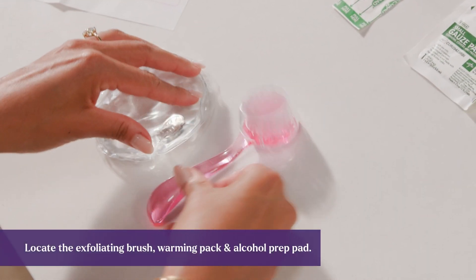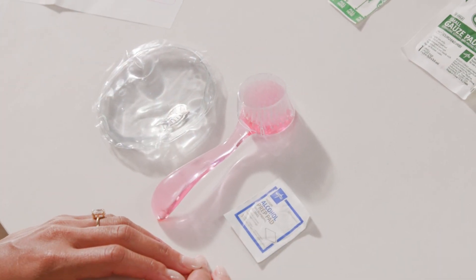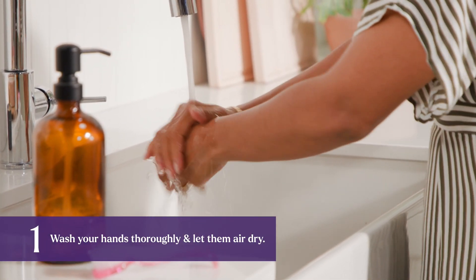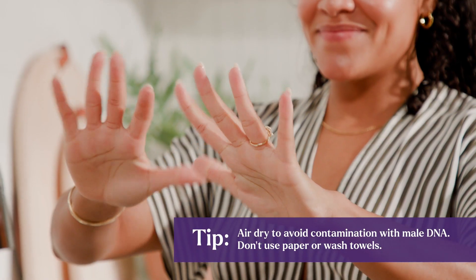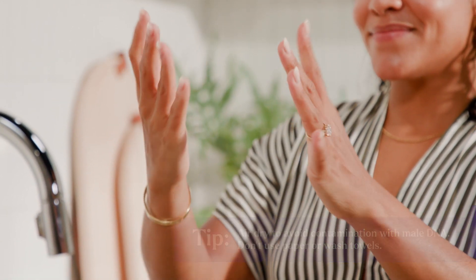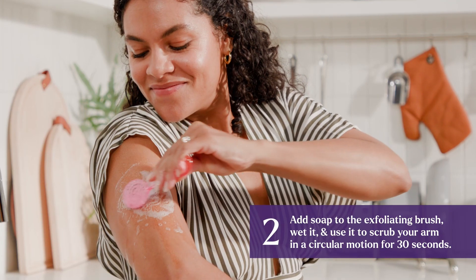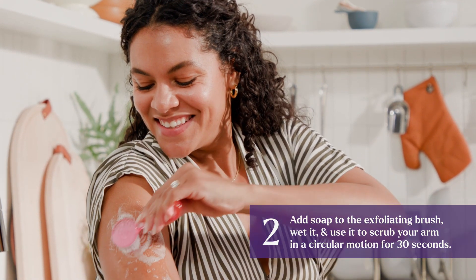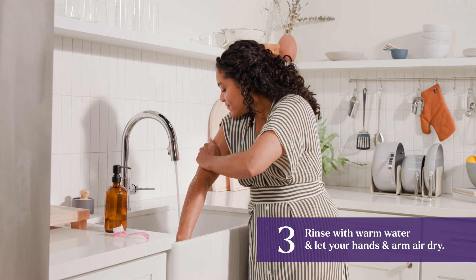Locate your exfoliating brush, warming pack, and alcohol prep pad. First, wash your hands thoroughly and let them air dry. Then add soap to the exfoliating brush, wet it, and use it to scrub a flat spot on the outside of your non-dominant arm in a circular motion for 30 seconds. Then rinse with warm water and let your hands and arm air dry.